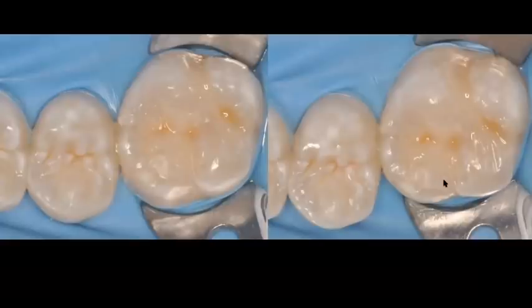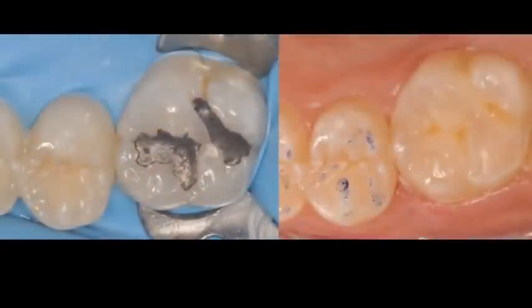So I'm trying to reproduce nature just by using this successive cusp buildup technique or concepts, with the idea that at the end of my restoration, when I have to adjust the occlusion, if you look at my completed restoration on the previous photo, and then you look at my finally polished and occlusally adjusted restoration, there's very little difference, because again, my adjustment is going to be minimal. And that's one of the things that I like about this technique.